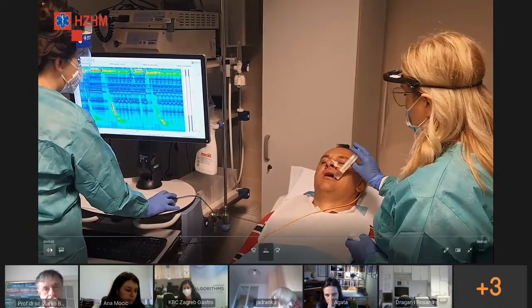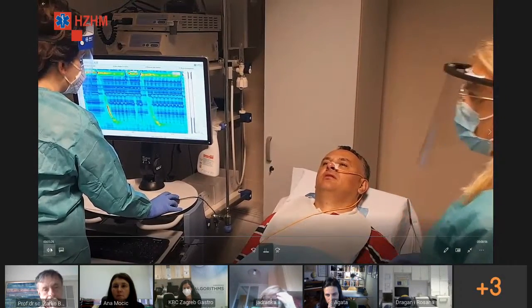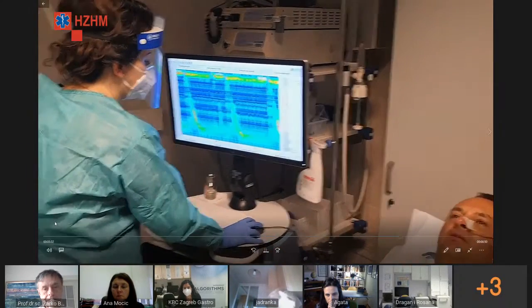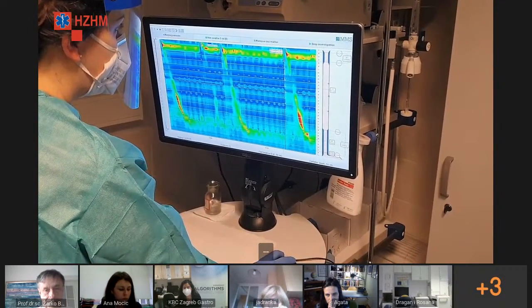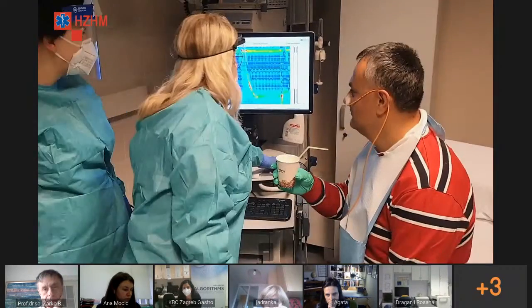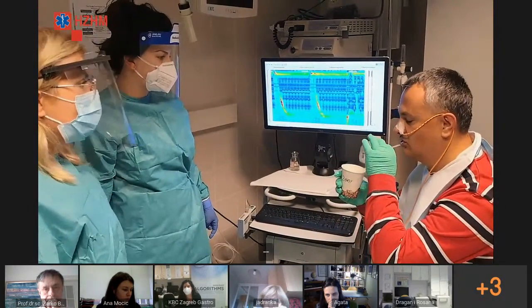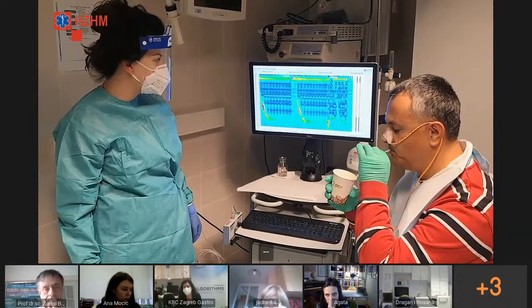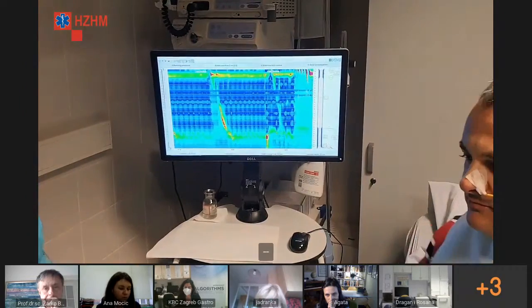Možete tako, gospodine? Znači, opet 10 sekundi nemamo gutanja i onda nastavljamo. Ono što sad slijedi, vidjet ćete, 5-6 gutanja napraviti jedan za drugim, onako kao da se želite dobro napiti. Ne morate. Dobro, okej. Još nećemo pričati s vama.